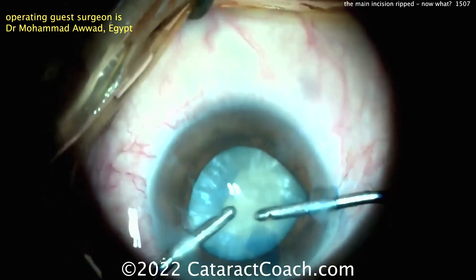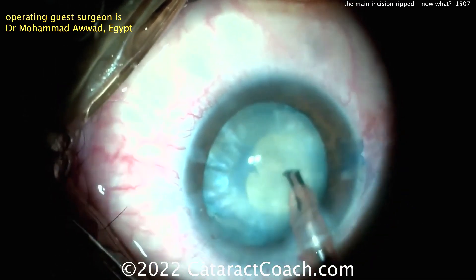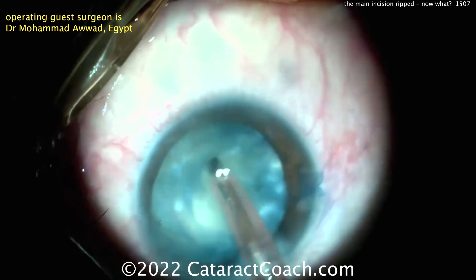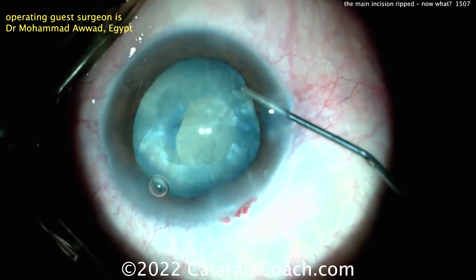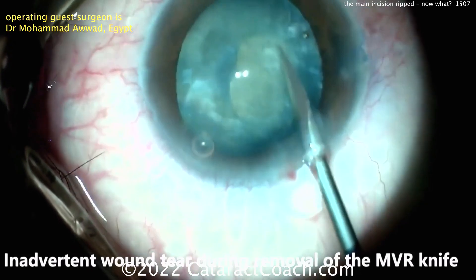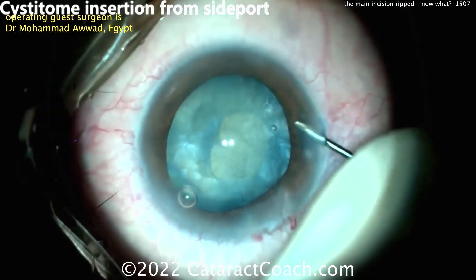With bimanual technique, able to go in and remove a lot of the liquefied lens cortex. Now going back inside the eye, here's the FACO probe to remove some of that lens material. Definitely going to want to open up this rhexis to make it a little bit larger once you get this nucleus depressurized. More viscoelastic going inside the eye. Now going in with a blade to start nicking the capsule to increase the size of the rhexis — and inadvertent tear of the incision with that blade. Wow. So there's a tear there now.